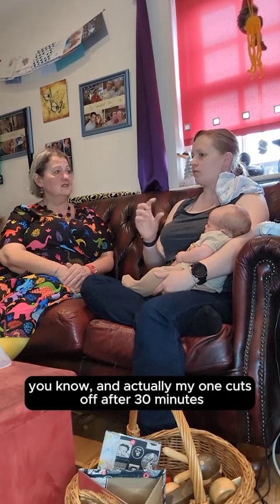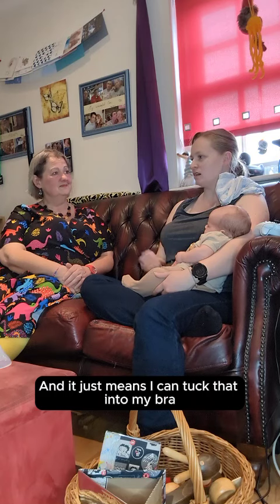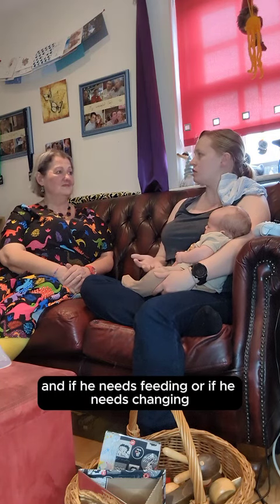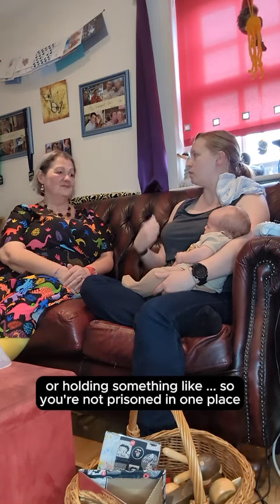And my one cuts off after 30 minutes, so then you don't have to try and remember to keep an eye on how much you're expressing. And it just means I can tuck that into my bra, and if he needs feeding or if he needs changing, I can still do whatever I need to do without having to worry about cables or holding something.